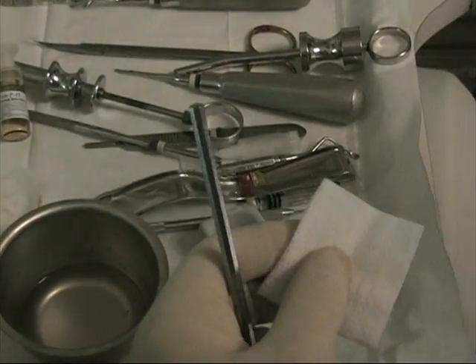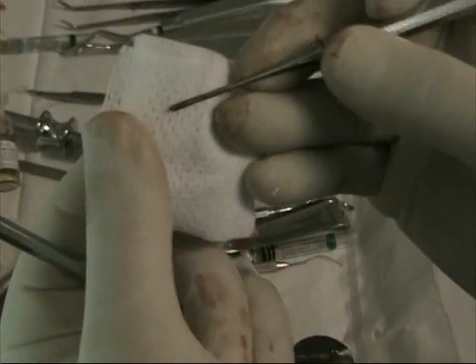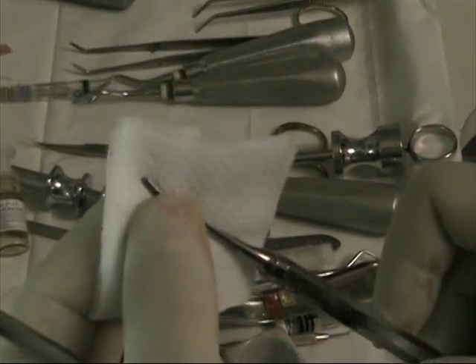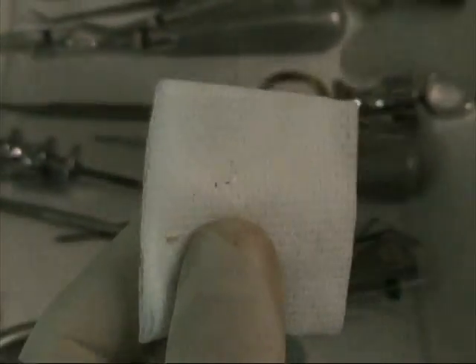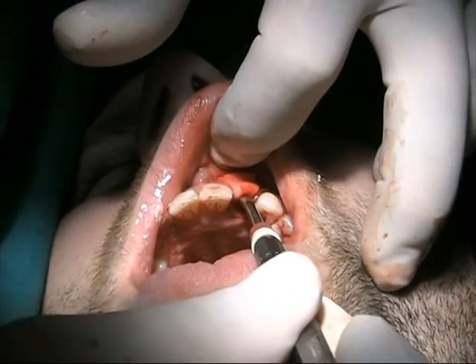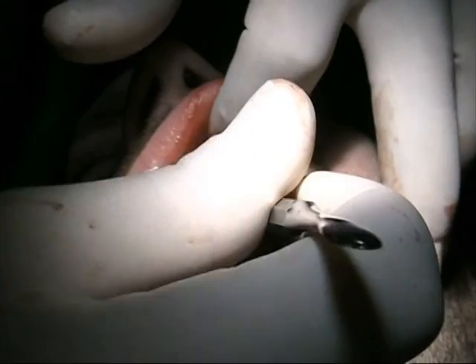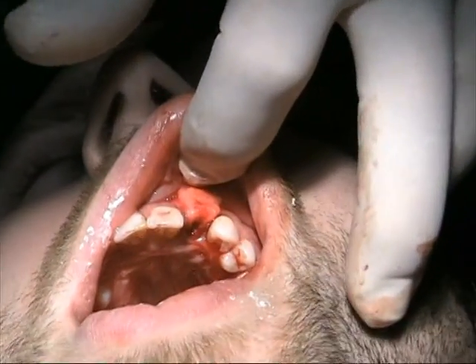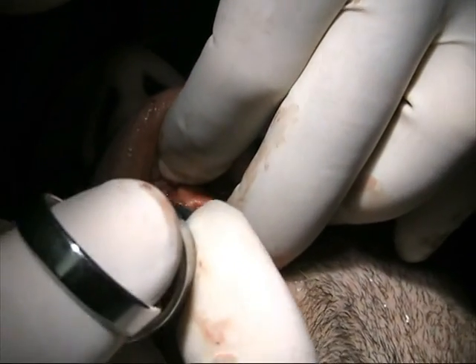I've placed the membrane using my membrane-placing instrument, which is really nice to have. You can see the sharp tip that allows you to grab the membrane and a very fine flat blade to bring it down along the facial plate as well. The membrane is ready. We're now going to place the bone graft in the site. I've already tucked it in between the mucosa and the facial plate, and the void that we want to fill on the facial area is right there. Because I have this in my injection system I can put the material right where I want it to go.